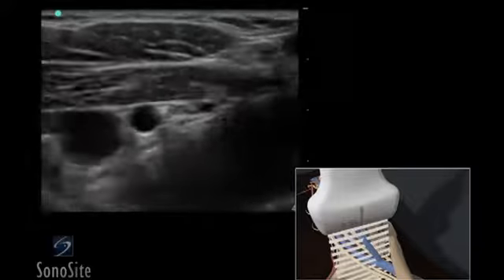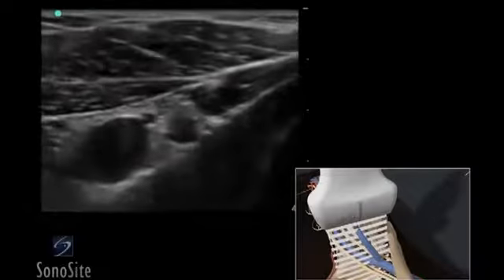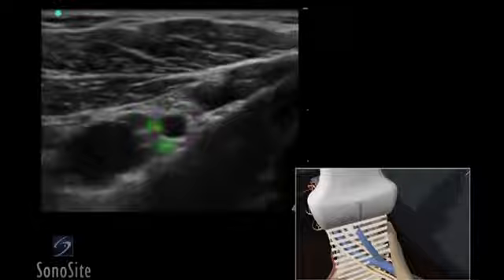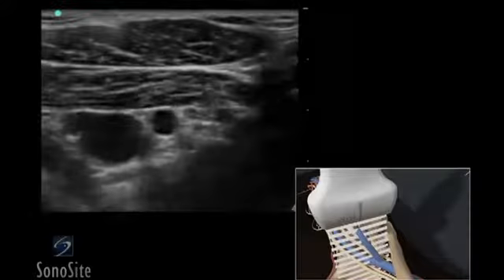The transducer is slowly moved in a lateral direction following the course of the axillary artery. The nerves will split into a lateral, medial, and posterior cord. The optimum position of the transducer for the infraclavicular nerve block is as lateral as possible.